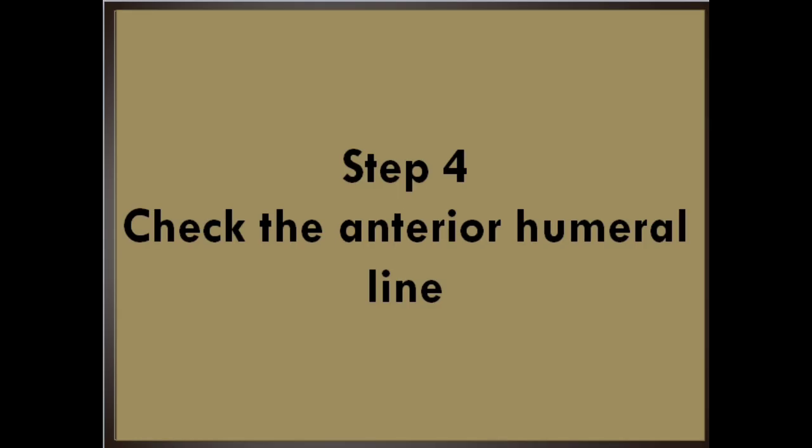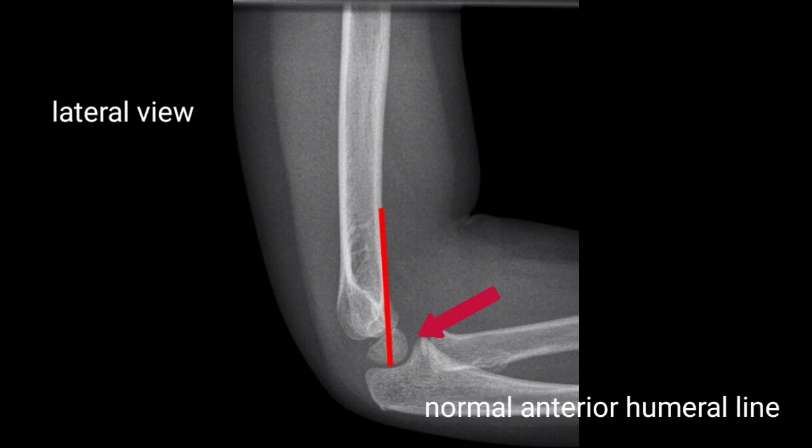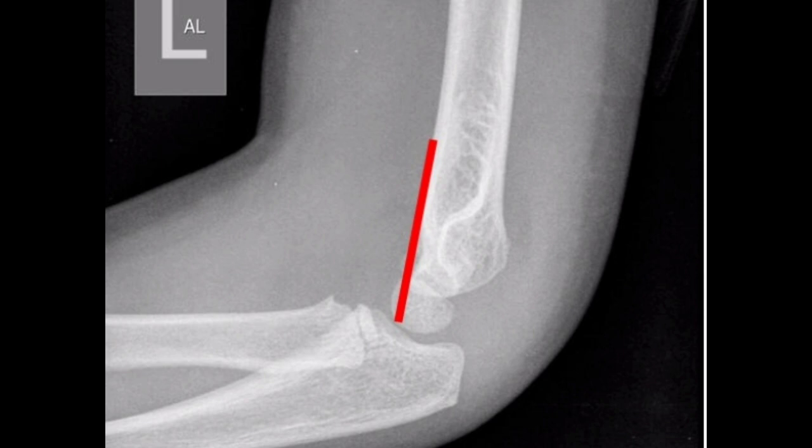Step 4: Check the anterior humeral line. Draw a line along the anterior aspect of the distal humerus on the lateral view. This line should intersect the middle of the capitellum. If it intersects the capitellum through the anterior third, or if it misses it entirely, it suggests a fracture with posterior angulation of the distal humerus. This radiograph shows a normal anterior humeral line. This radiograph demonstrates abnormal alignment of the anterior humeral line, strongly suspicious for fracture.